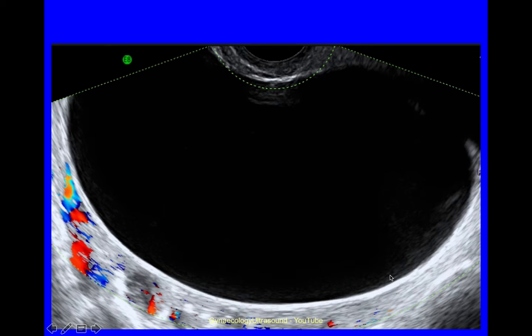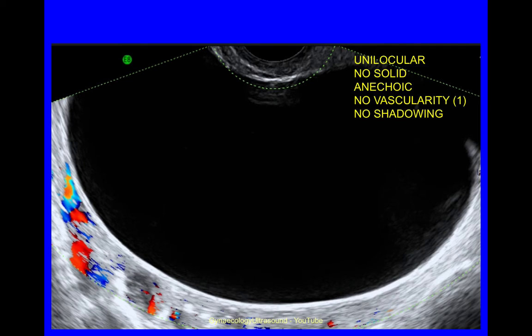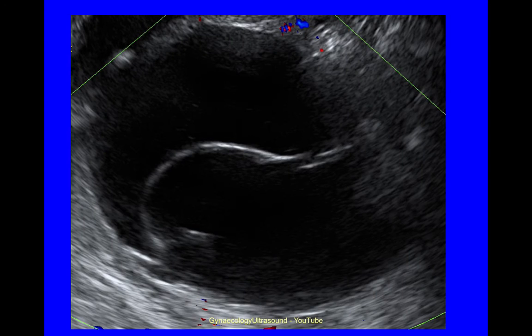Once a cyst is larger than 100mm or 10cm, you have to be very careful that you might not be able to see a little bit of solid material very distant from the probe. Around 10cm is about as far as you can see, and beyond that you can call it unilocular but note it is slightly beyond the visible range. This next cyst is multilocular, no solid material, anechoic cyst contents, no vascularity and no shadowing.